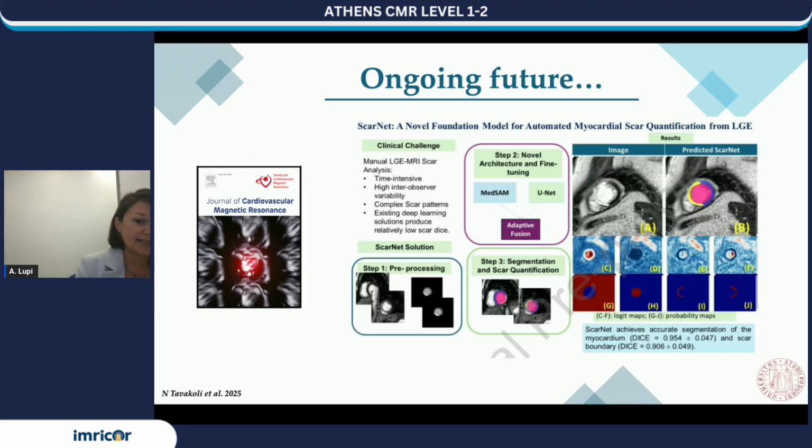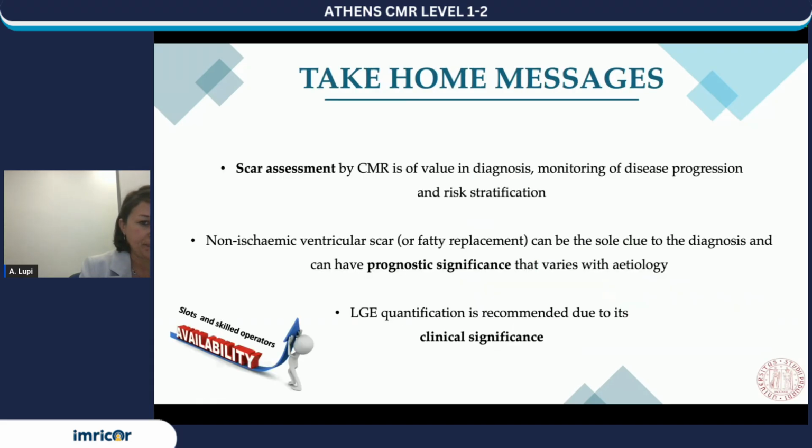These models are very long to address, but in particular in this paper, I found a model that outperformed very well compared to the previous models present.